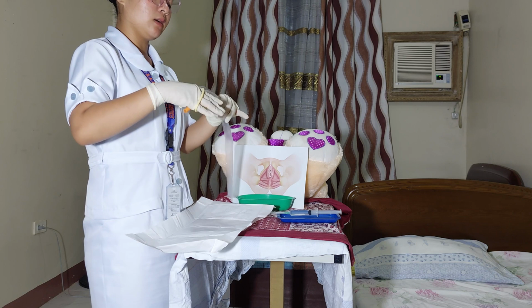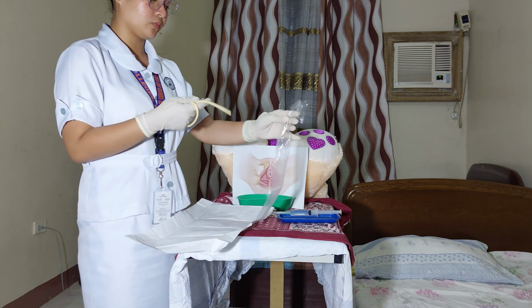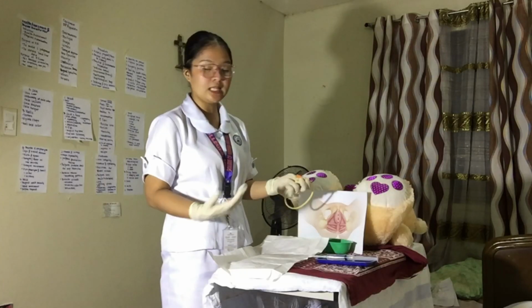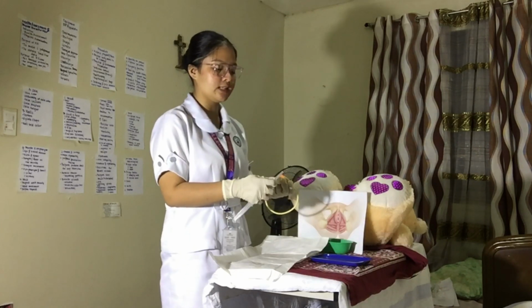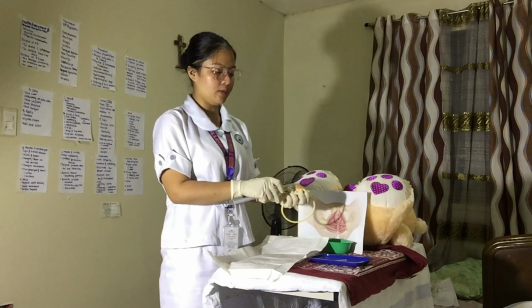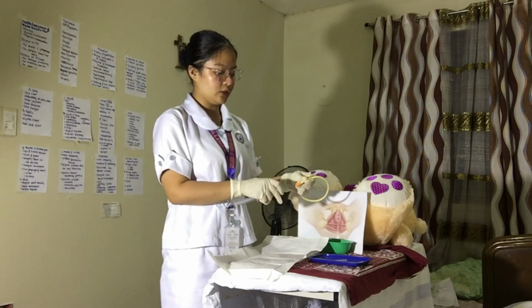So, para hindi siya kung punta-punta kung saan-saan, is I'm going to wrap it around my hands, tapos insert 8 ml na saline water solution or sterile water sa dito para ma-check if kung naggagana ba yung balloon ng aking Foley catheter.